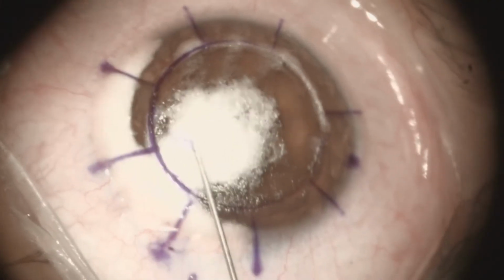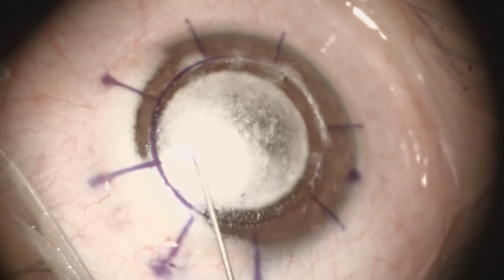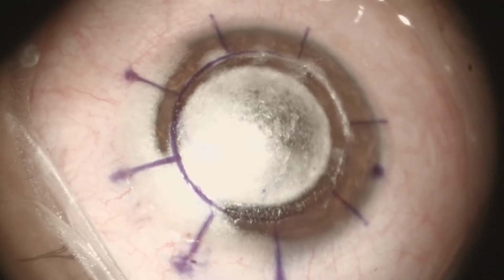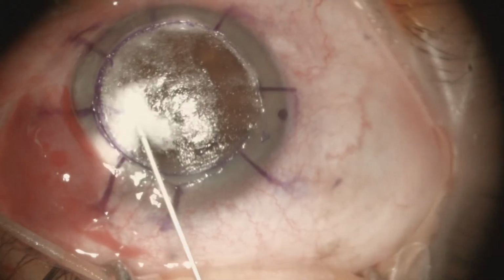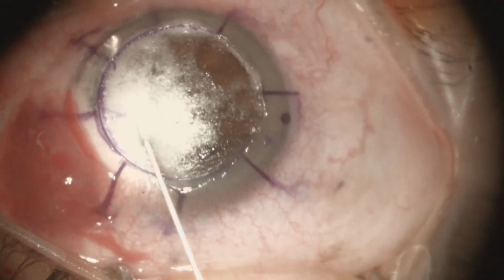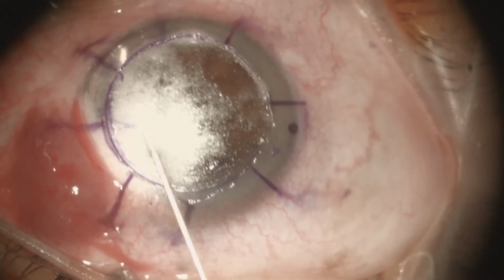Normally, injected air will diffuse through the corneal stroma and, on reaching the posterior lamella, it separates the Dua's layer from the deep stroma, forming a type 1 big bubble. A defect in the Dua's layer may allow air passage to separate the Descemet's membrane, resulting in the formation of a type 2 big bubble.